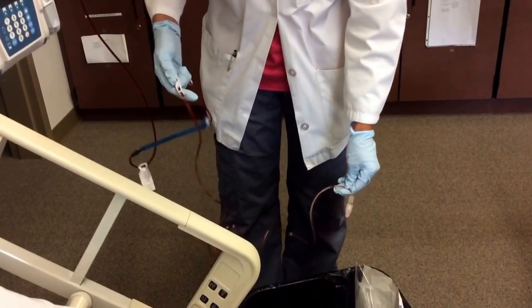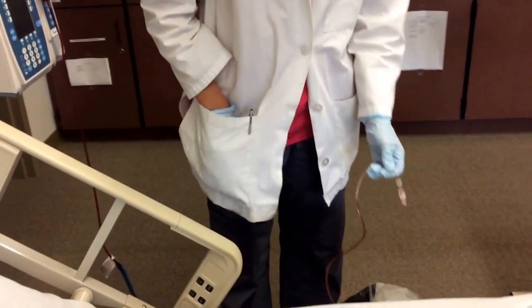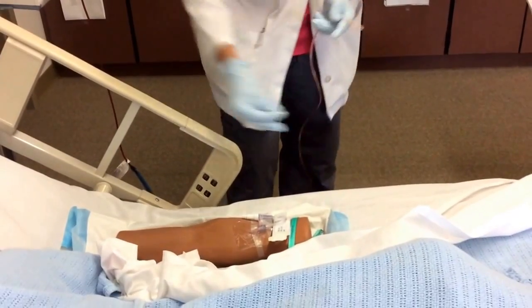Okay, and now I have pink down to the hub. So at this point, I'm going to connect this to his IV.